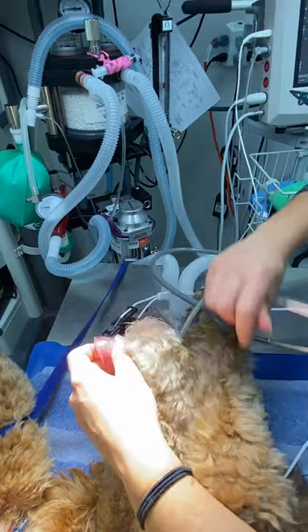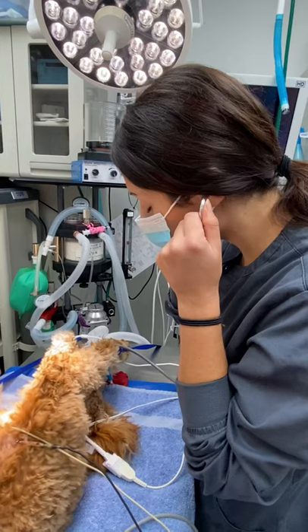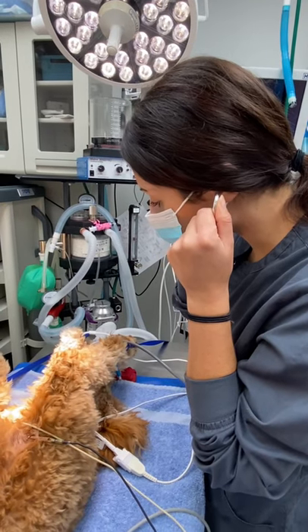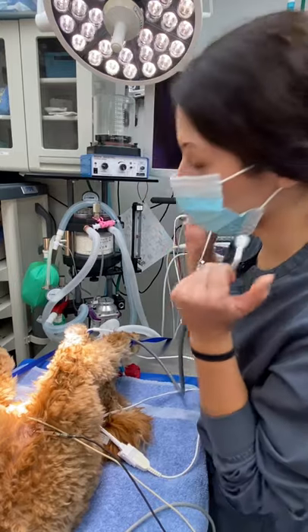What this does is it kind of echoes the heartbeat for you, and you can also get a good respiratory rate. You just make sure it's in a good spot when you can hear the heart rate and respiratory rate, and you're good.